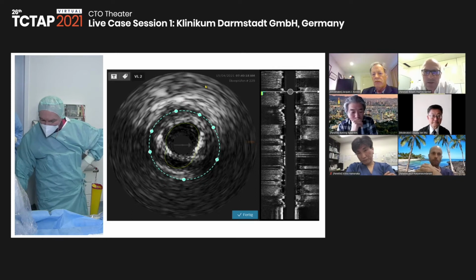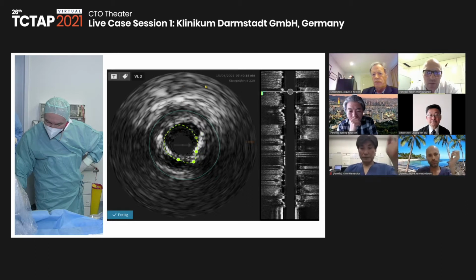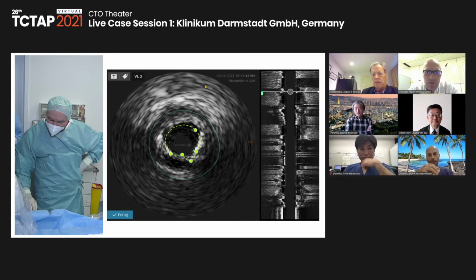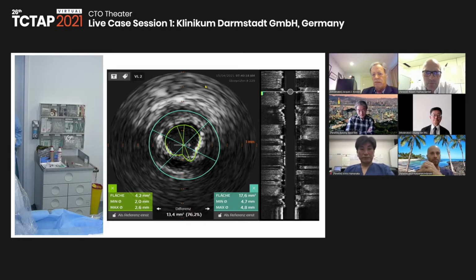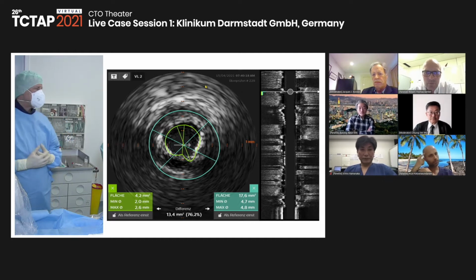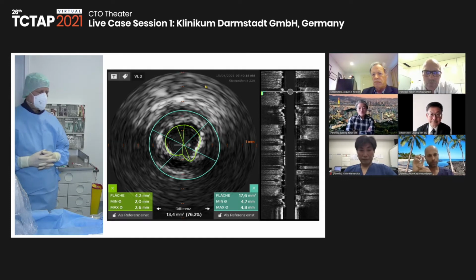It looks surprisingly soft to me. Angiographically, I would have expected more calcification on the IVUS. He's a young guy, so maybe the plaque isn't as calcified as you think. Yeah, but the calcification comes down distal, in the middle segment. Okay. And actually on the CT, it looked even full moon. I'm not sure whether this is representative. Maybe the CT was not accurate enough.